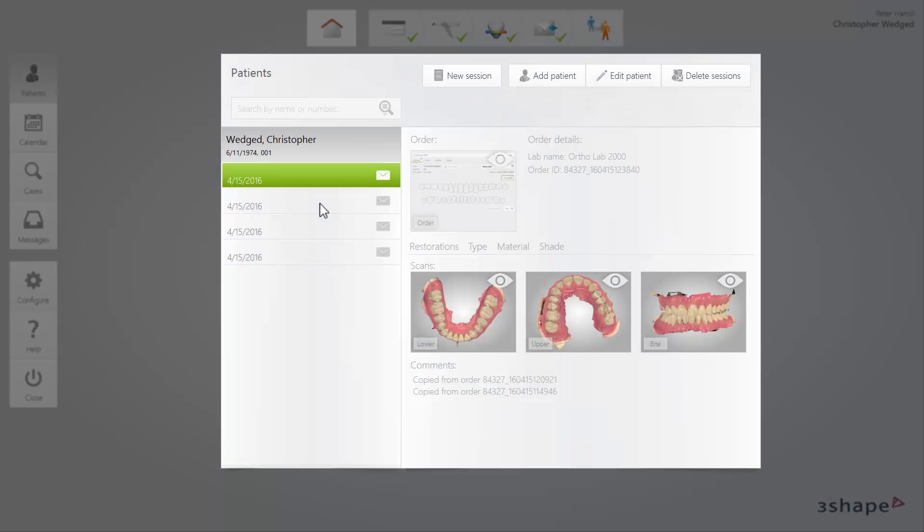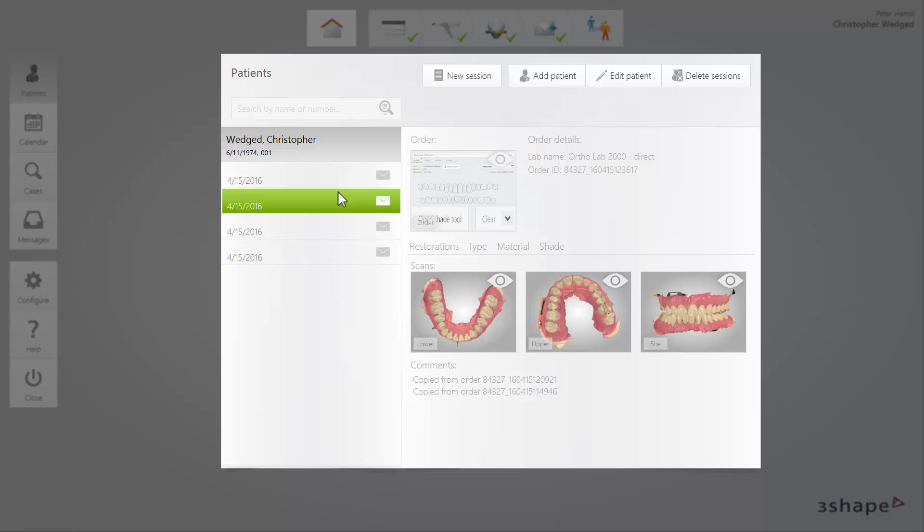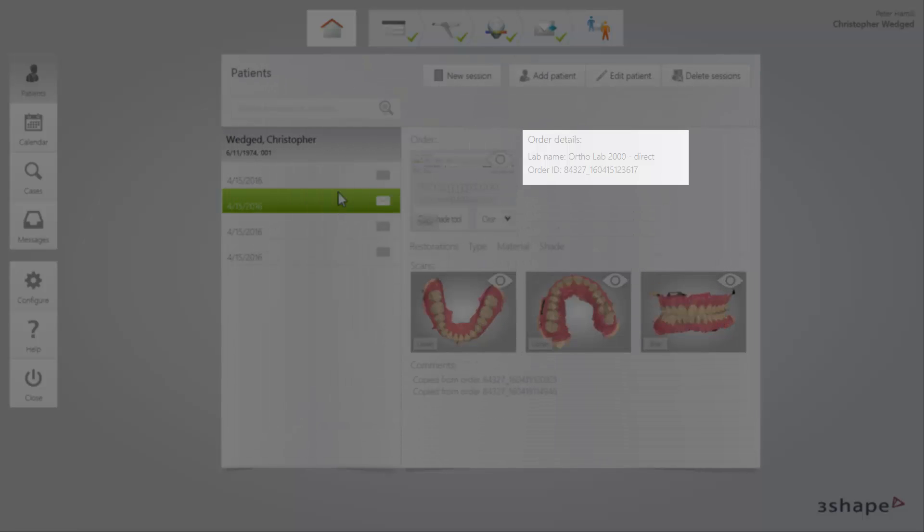When on the Patients page, after choosing the patient, you will find the Sent Orders on the list. The Destination Lab is specified in the order details.